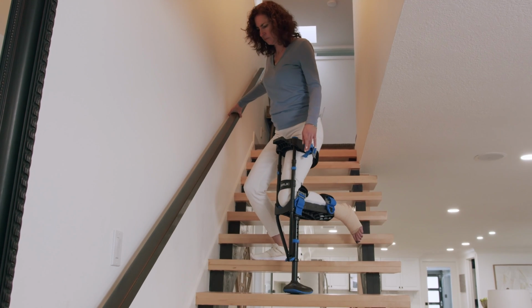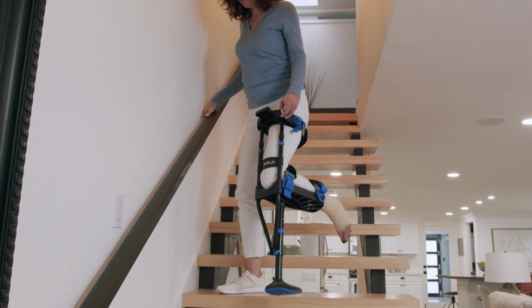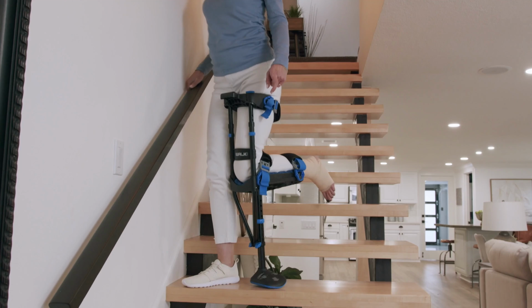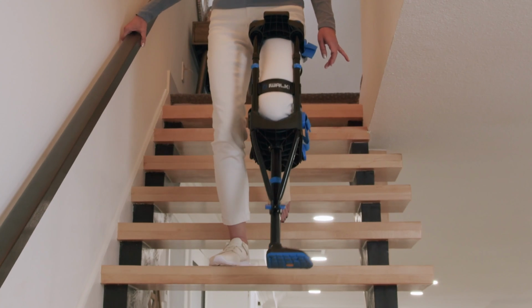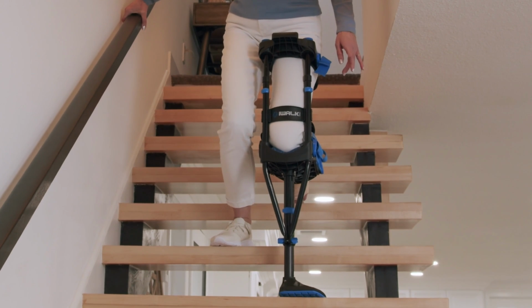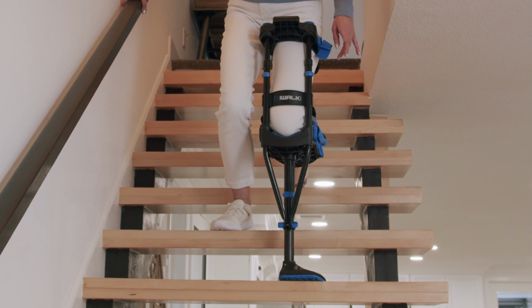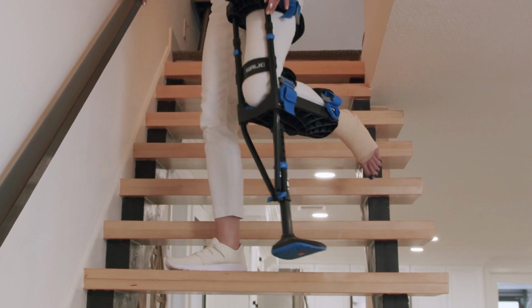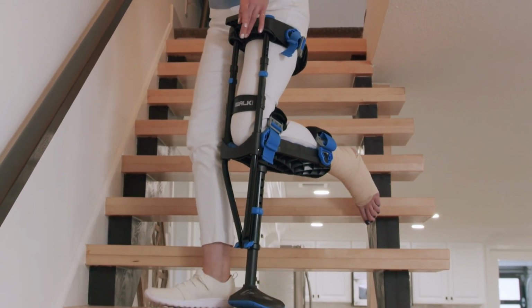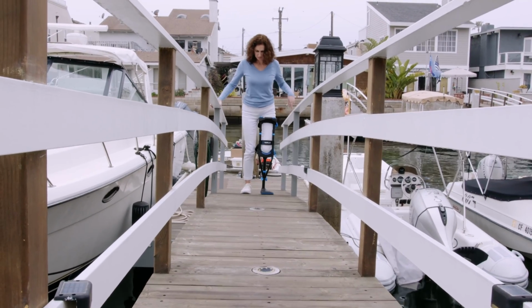An alternative method for descending has the patient facing forward. This method only works if the handrail is on the opposite side as the iWALK leg. Lead with the iWALK leg. Note that you cannot face straight down because the foot of the injured leg will hit the uphill tread. To keep this from happening, turn partially sideways, then proceed down with the iWALK leg. Follow with the good leg, going one step at a time. When walking up or down slopes, your patient uses the same technique as when navigating stairs.